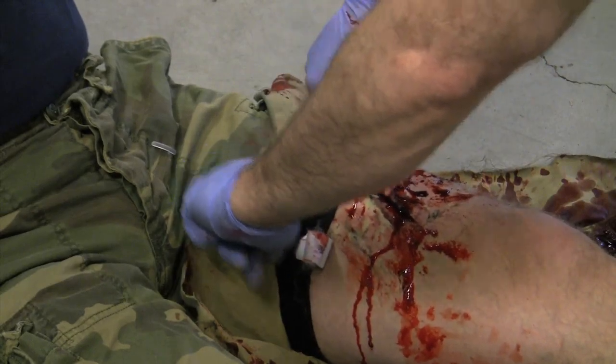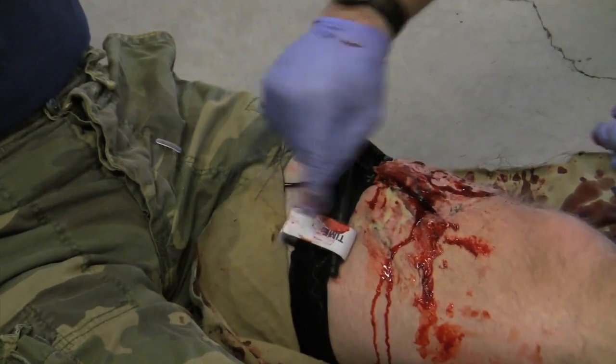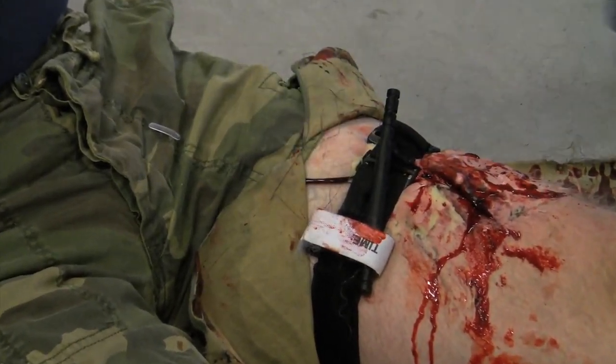Now take the windlass strap and secure it to the windlass clip. Record the time of tourniquet application. The patient is now ready for transport.